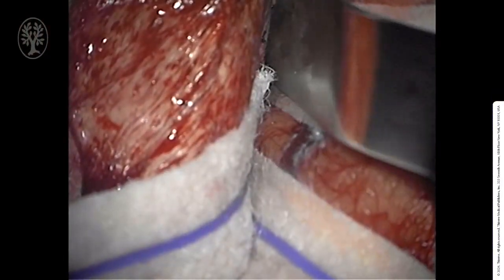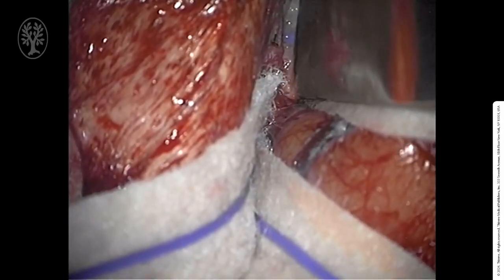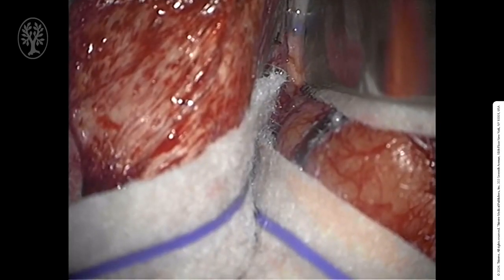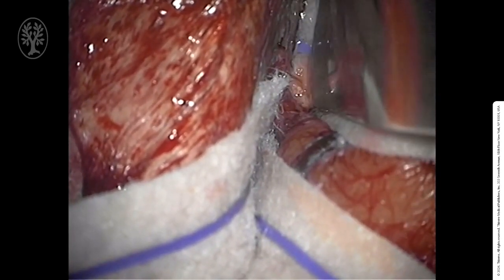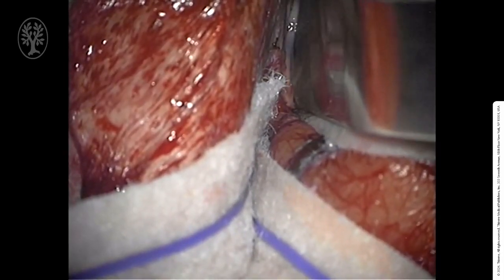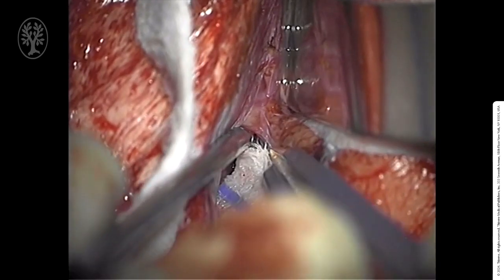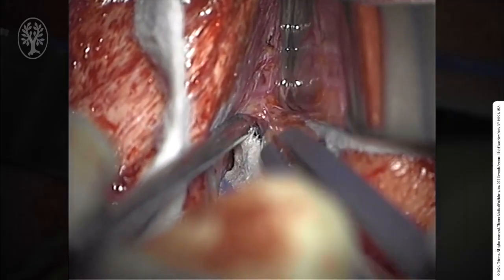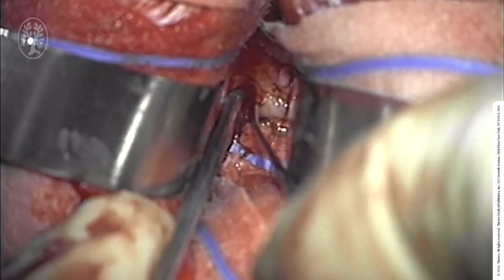As the dissection progresses more deeply, fixed retractors may assist with visualization. The surgeon should take great care to avoid retracting against the medial precentral gyrus. Just inferior to the falx, the cingulate sulcus and gyrus are encountered. This is often an area of particularly strong adhesions.